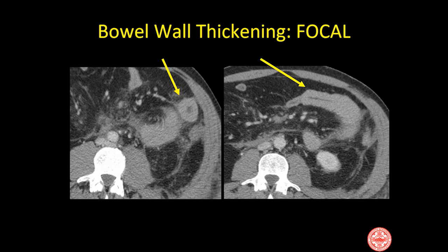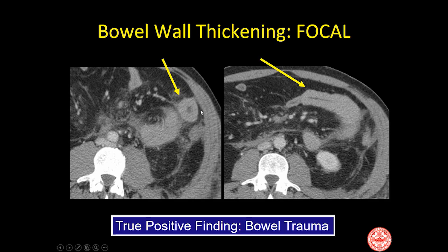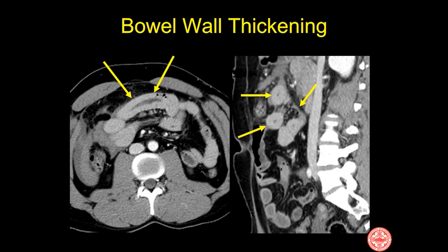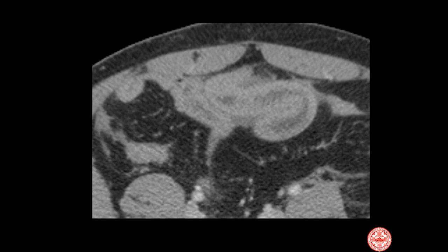Here we have one patient where axial images demonstrate a focal area of thickening in a loop of small bowel. Notice also that there is stranding and hematoma in the mesentery — a combination of findings highly specific for bowel trauma, proven at laparotomy. Another similar patient has a focally thickened loop of jejunum, hemoperitoneum, and blood in the mesentery. Notice in the sagittal reformation the triangular accumulations of blood between the leaves of the mesentery in the same area as the thickened loop — again, a very specific combination indicating bowel injury.